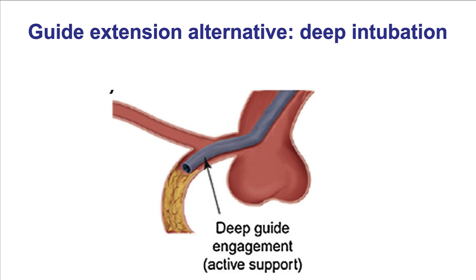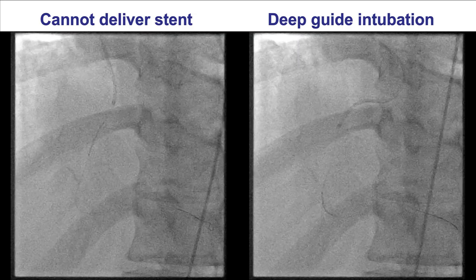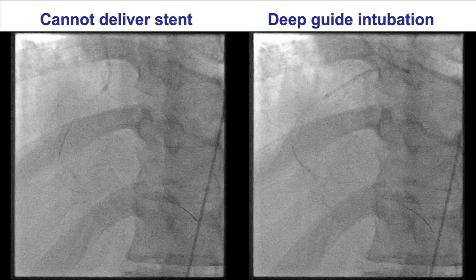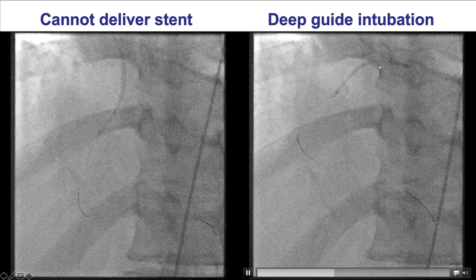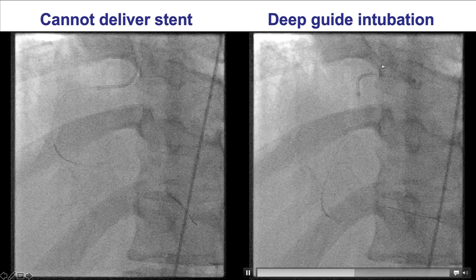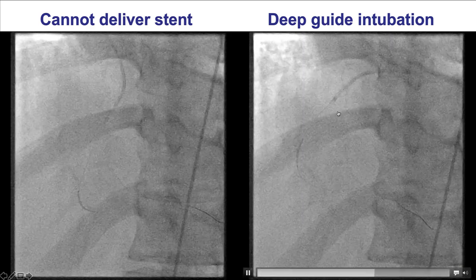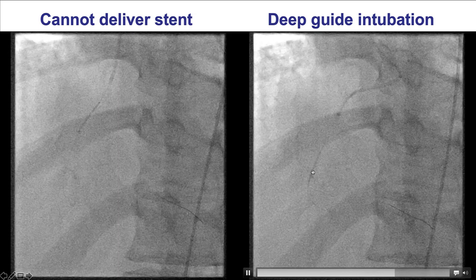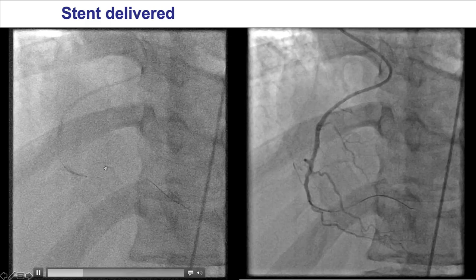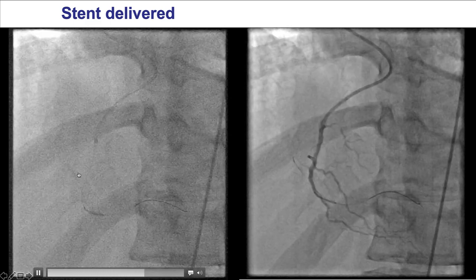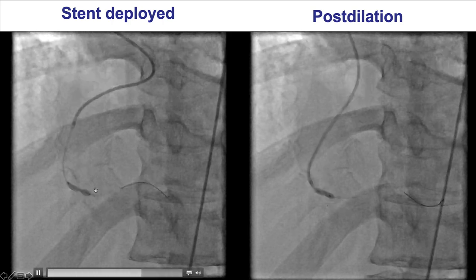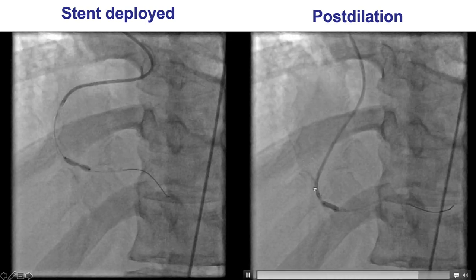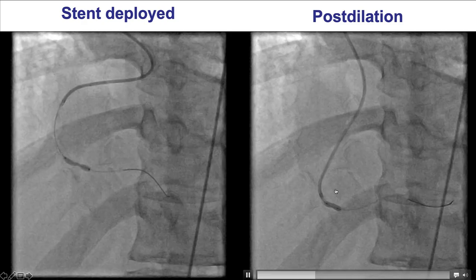There is, however, an alternative to using guide extensions if they're not available, which is to deeply intubate the guide catheter. This is mainly done for the right coronary and much less so for the left main. This is an example of challenging delivery in a complex right coronary artery lesion. Typically, the deep intubation is done by clockwise rotation and advancement. You can see the guide here is advanced to the proximal and mid-segment of the right coronary artery, helping with stent delivery. Eventually the guide catheter came all the way down almost to the distal RCA, facilitating post-dilation of the stent and achieving a nice final result.